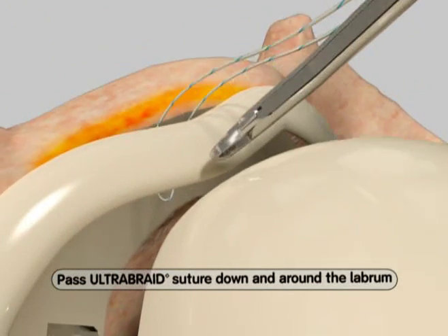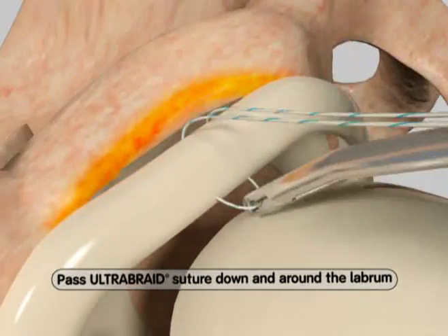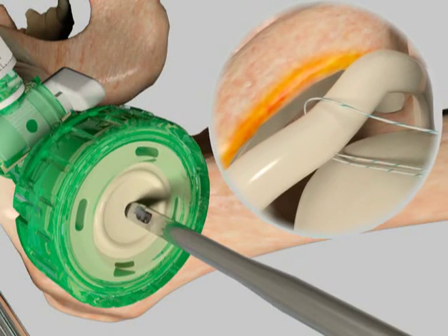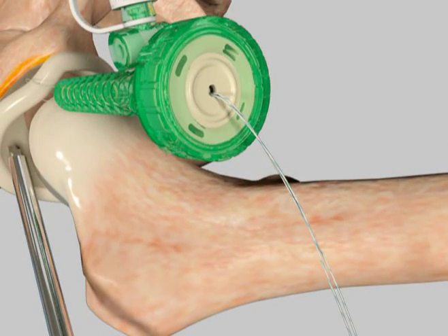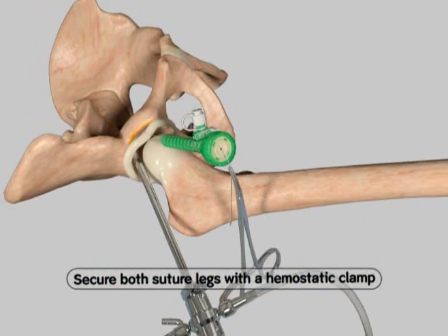The arthro-round device is then moved to the opposite side of the labral tissue to retrieve the suture limb that is in the joint. Once the suture limb is retrieved, it can be moved out of the same portal as the original limb. Both suture limbs can then be clamped using a hemostat in order to prevent slippage.